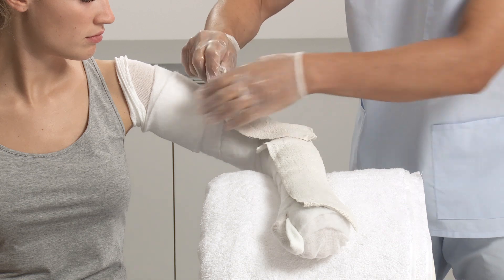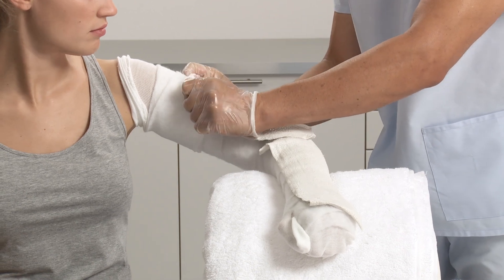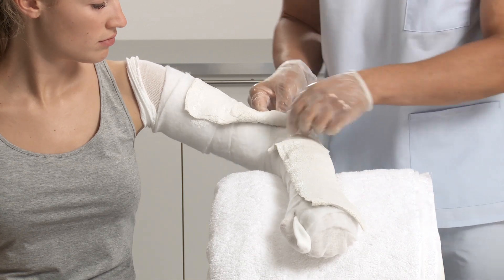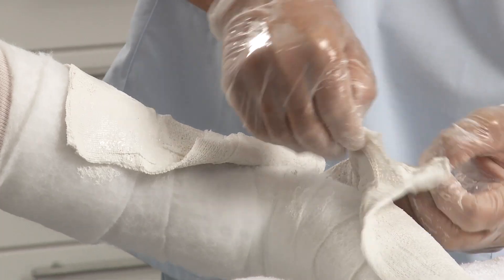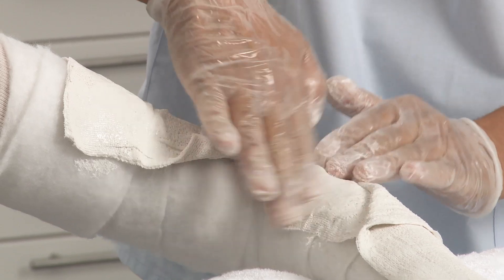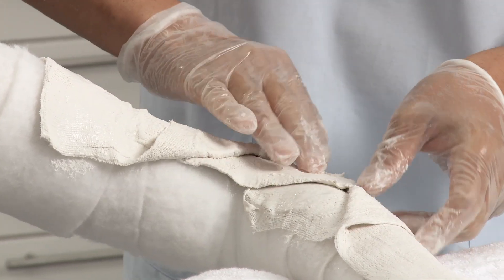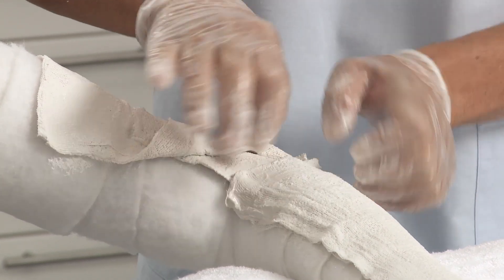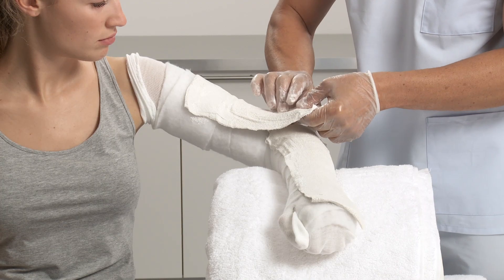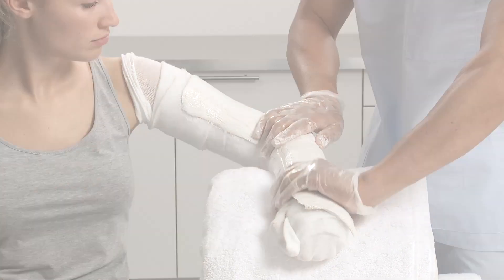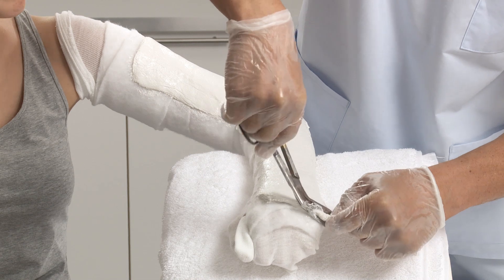Then apply the second splint onto the upper arm, overlapping with the first splint by intertwining the layers. Cut the splint to size.